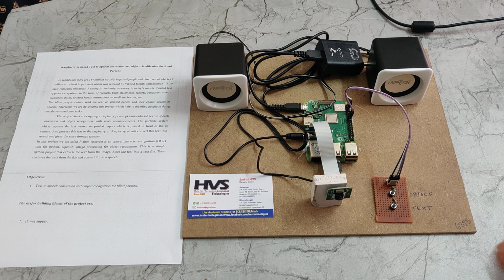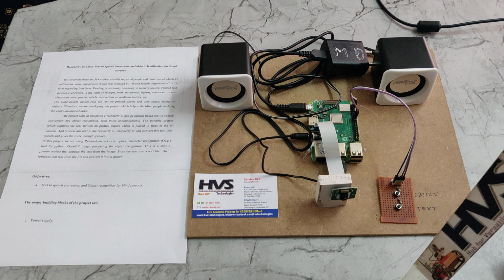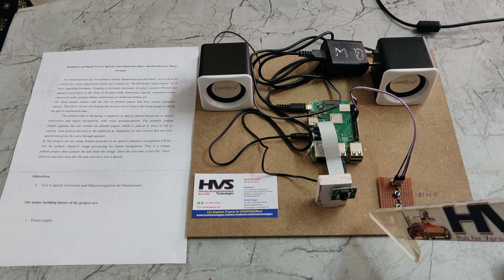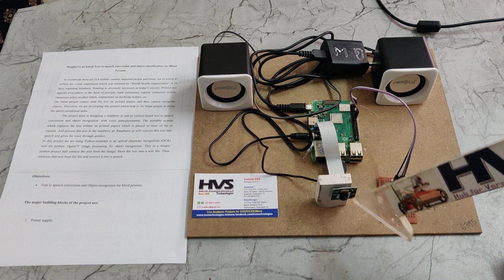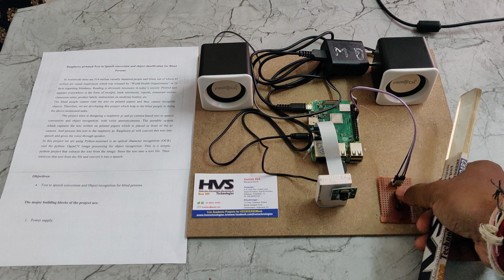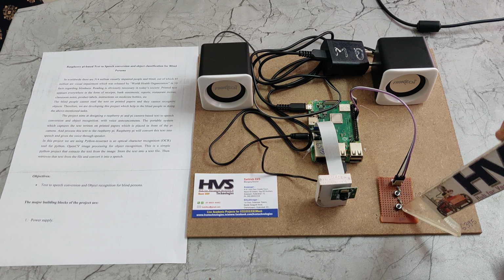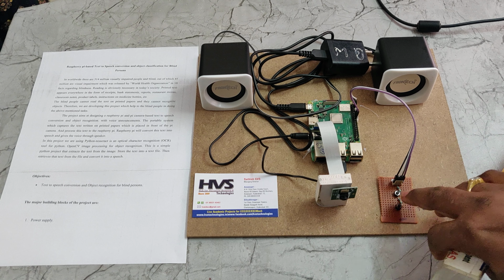Welcome to the first demonstration of Raspberry Pi based text-to-speech conversion and object detection and classification for blind persons. The main input of this project is the Pi camera. The main application is that it will capture the images in front of the camera, and based on the selection, it will extract the text when we select the text switch, and detect and classify the objects when we select this switch.